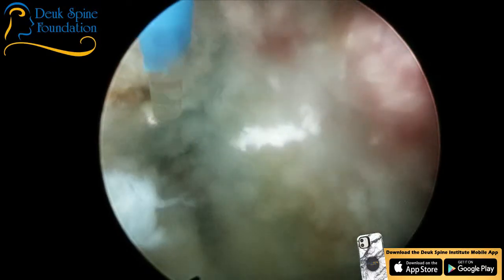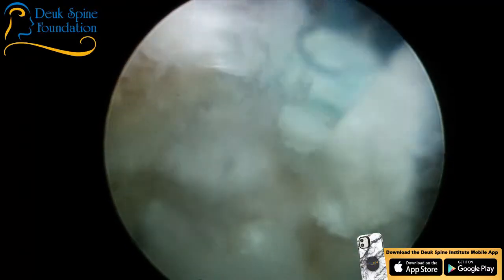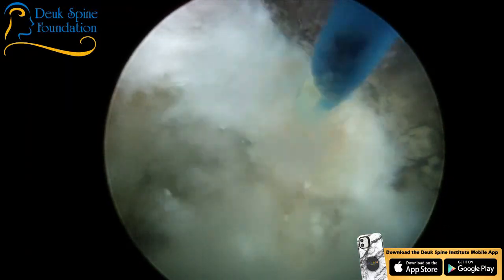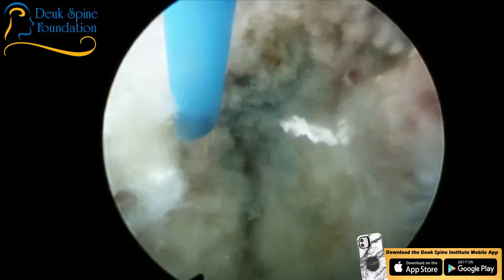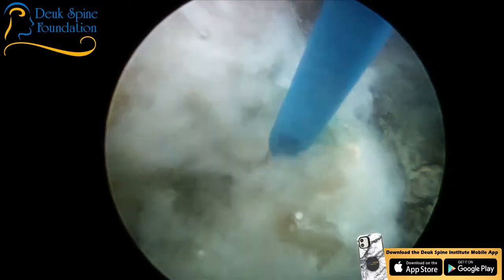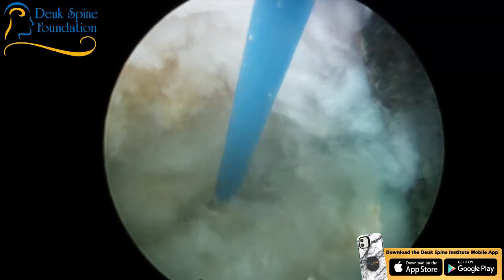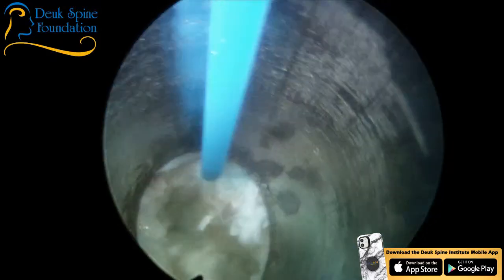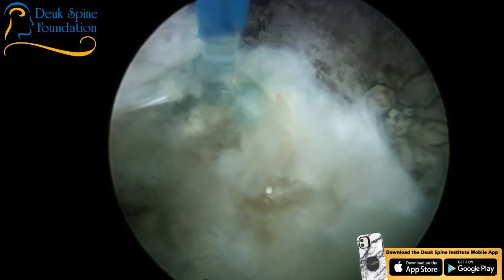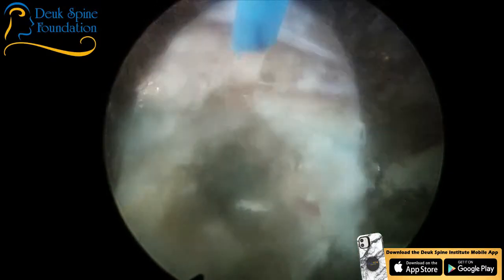30 seconds, and then we're going to get on to 5-1. There's that last part of the herniation and annular tear laterally. For those of you watching, this surgery requires you to restrict your activities afterwards. I have patients who don't listen. They feel so good, they just start lifting things or bending at the waist. Can't do that. You're going to re-injure your disc. You'll re-herniate. Our re-herniation rate is probably around 1.1% at this point. But virtually every single case, there's been something the patient's done they shouldn't have.